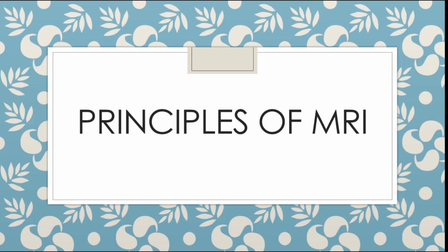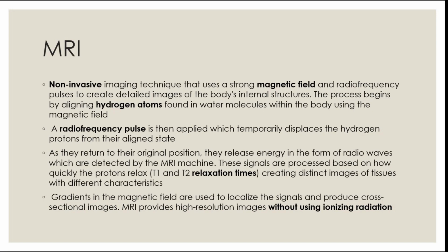Okay. So, for the principles of MRI, we just go quickly on how MRI works. It's a non-invasive technique. The most important thing is the presence of water molecules in the body, because your body and tissues are made up of water, and the water has hydrogen atoms.